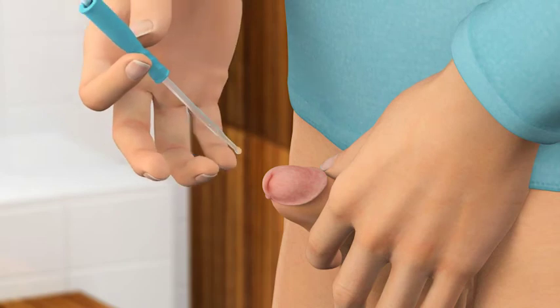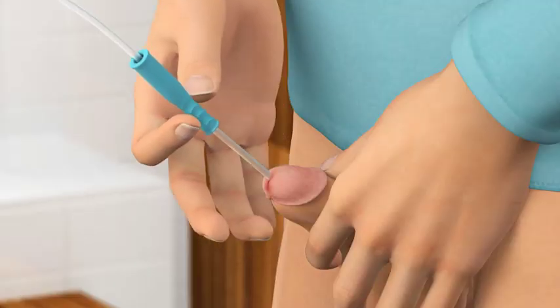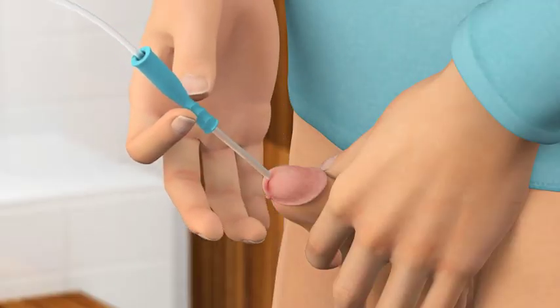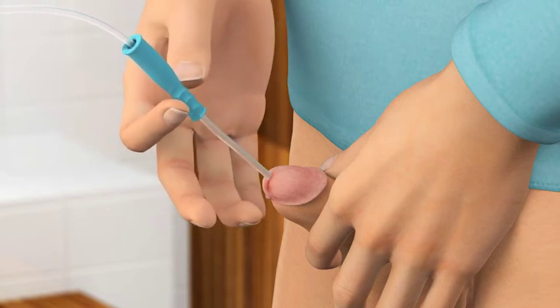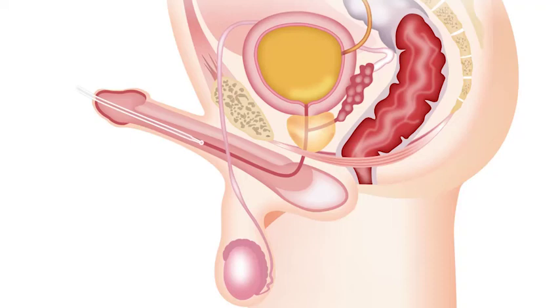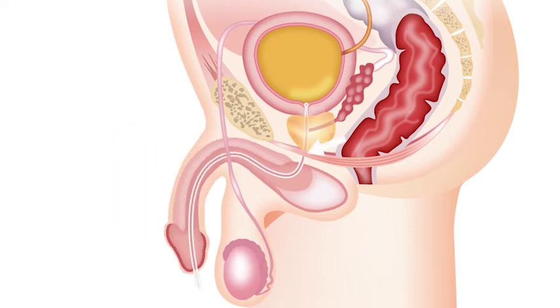Slowly and gently start pushing the catheter in while still pinching the insertion grip. Then release pressure on the grip to move it a bit further towards the connector. Repeat the pinch-push-release action of the insertion grip to continue inserting the catheter. Do not squeeze the penis, as this may make inserting the catheter more difficult. It is normal to feel resistance from the prostate or the sphincter muscle at the bottom of the bladder.